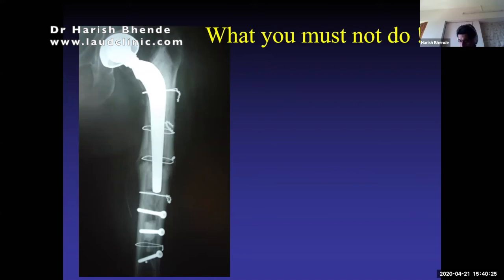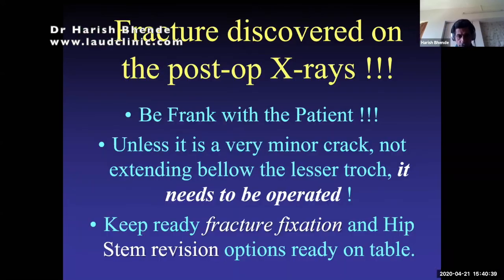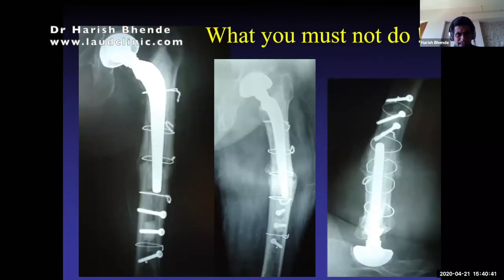You can expect exactly what will happen in the subsequent X-rays. Gradually the whole area starts sinking, and eventually everything fell down and the fracture got into problems, requiring a full-fledged revision and a new big surgery.